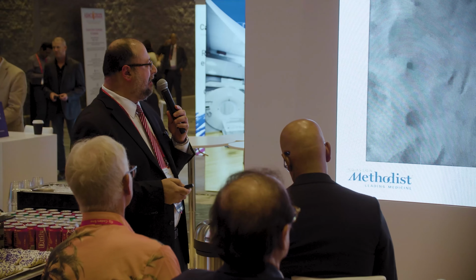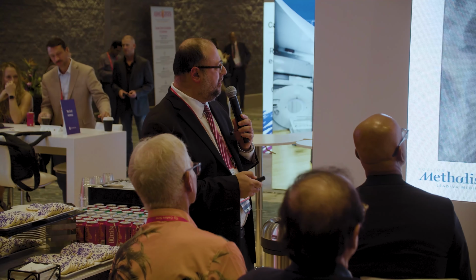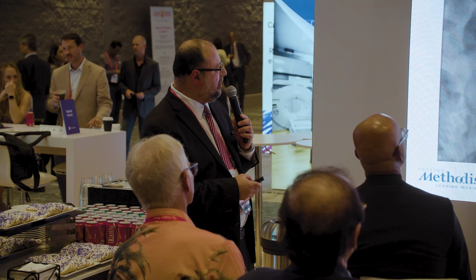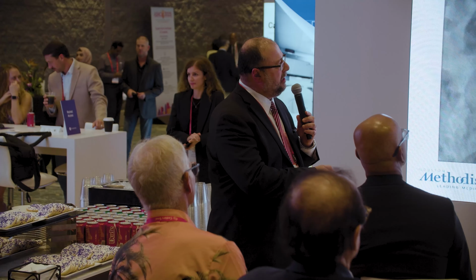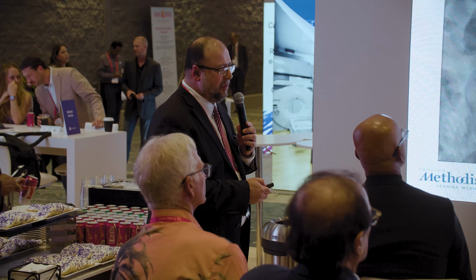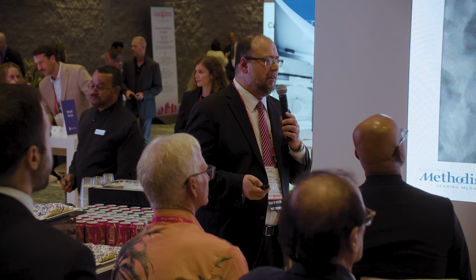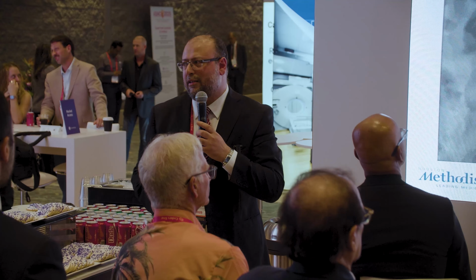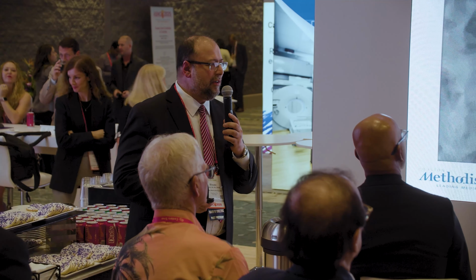Unfortunately, I can't. Let me see if I go back, if it runs again. Yeah, so you can see the LAD lesion very distally, and it was stented there. Any questions? So it's a distal LAD lesion that was responsible for this ischemic defect. Any question?